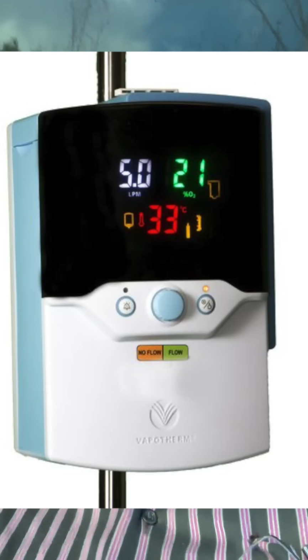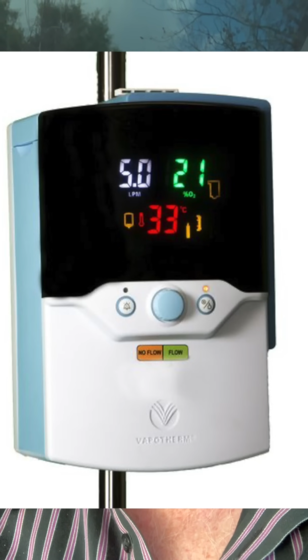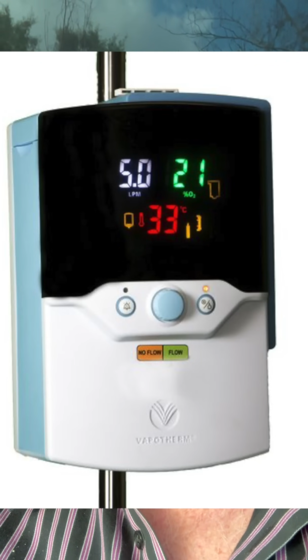A Vapotherm is a heavily marketed, very expensive device that also provides heated high-flow oxygen at higher levels. Some people say that using this actually adds a little bit of end-expiratory positive airway pressure, much like putting somebody on PEEP on the ventilator or CPAP, but the level of pressure generated by the high flows on these devices is probably only in the 3 or 4 centimeter of water range at best. That can help some, but it's not that great a shake.